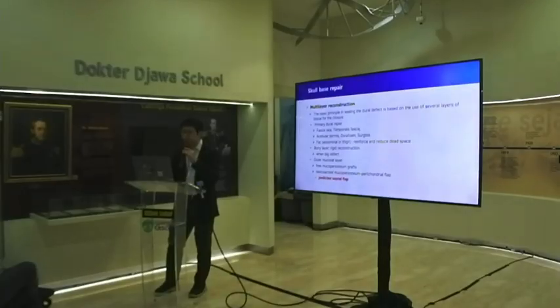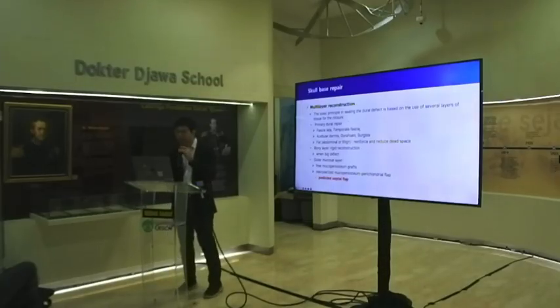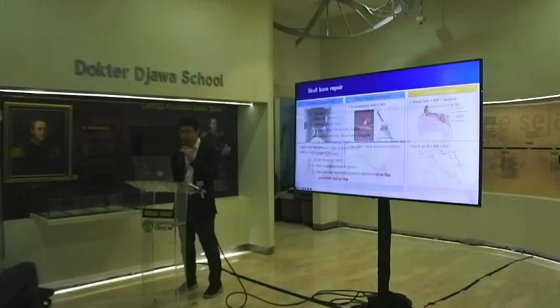The idea is to use multiple layers of tissue to seal the dural defect. This often includes primary dural repair with materials like fascia or fat for reinforcement, and a bony layer or rigid reconstruction like this step.